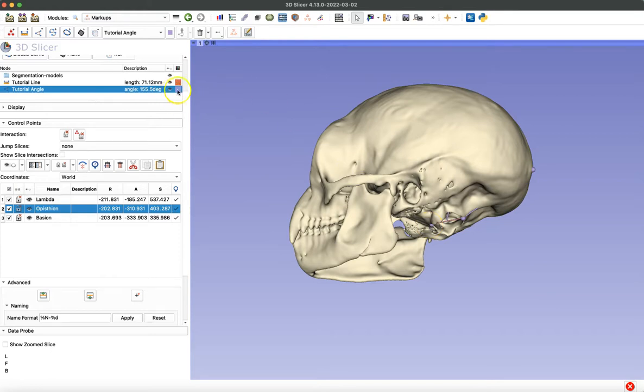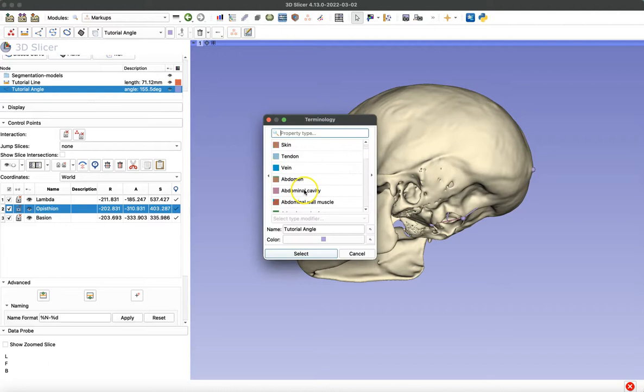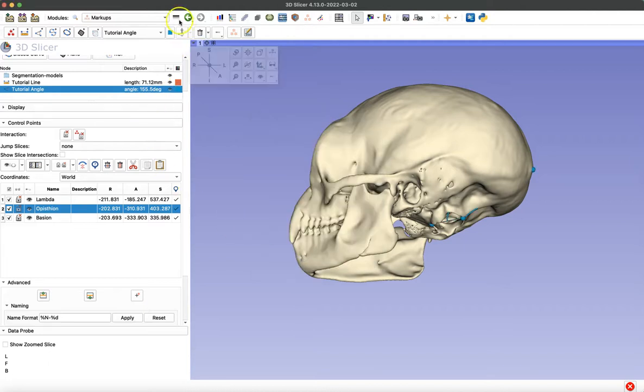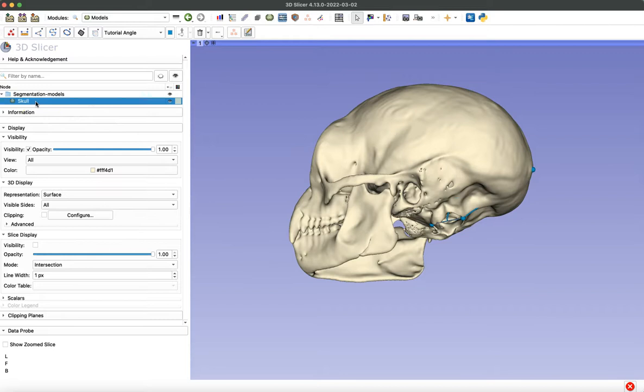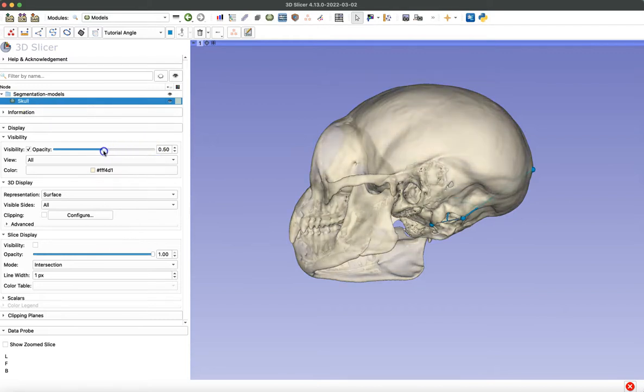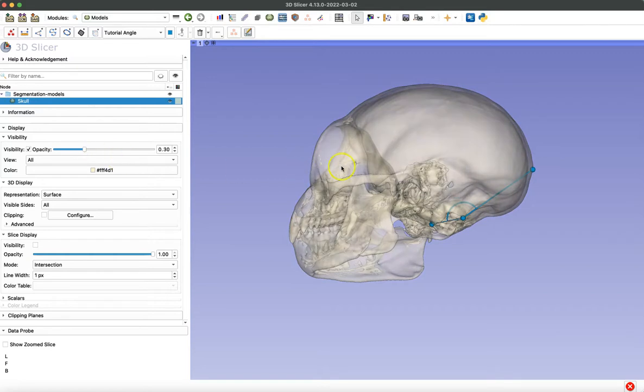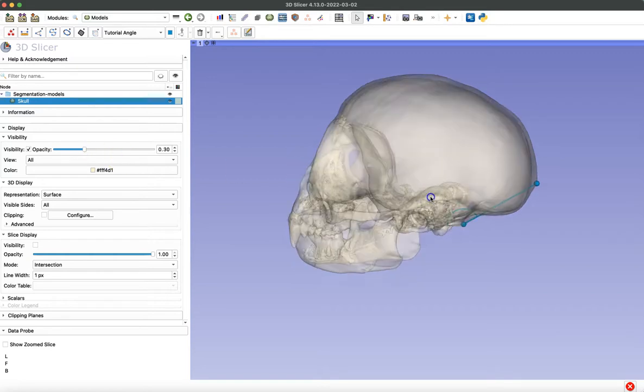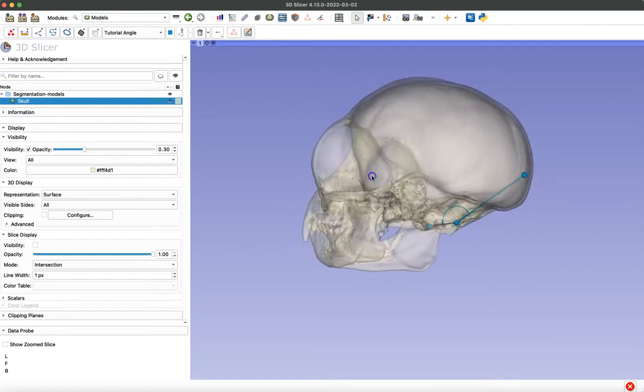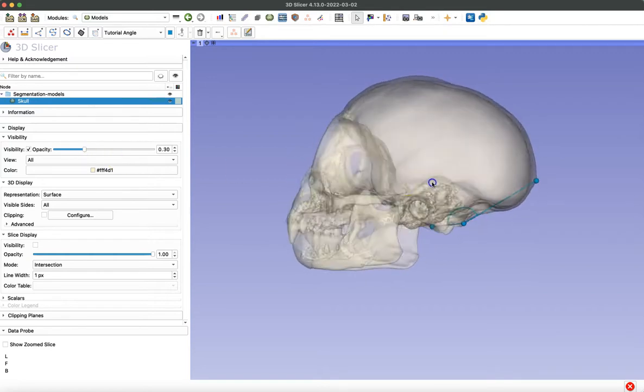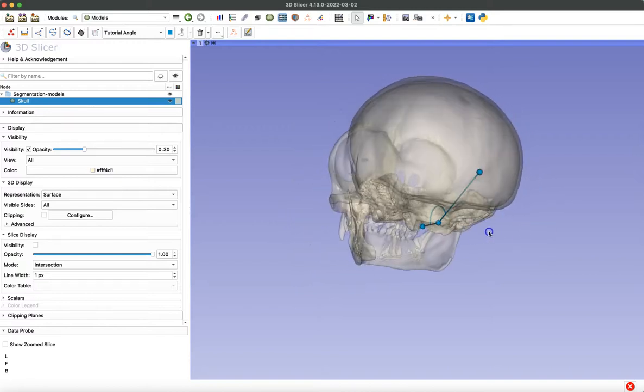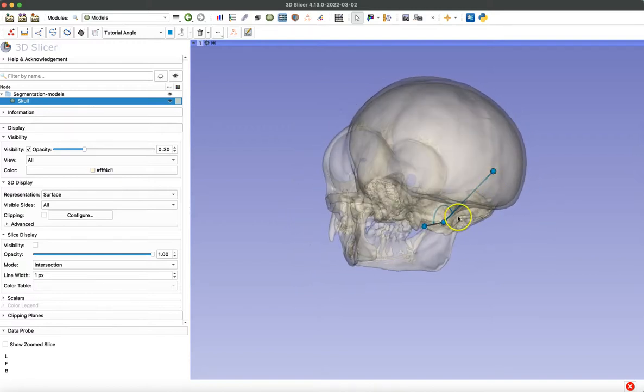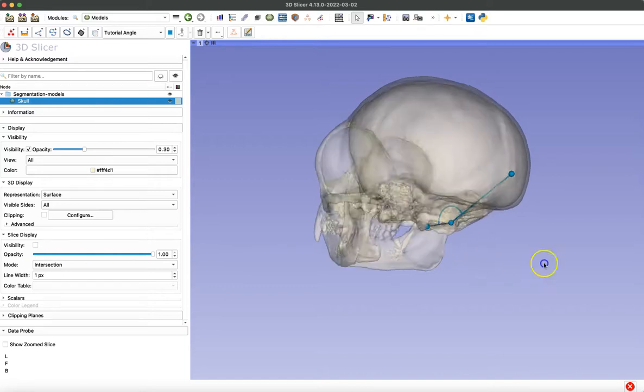I'm going to change the color of that angle we just created and navigate to the models module. Select the skull model that we already have and adjust that opacity so that we can see our angle better. And this is a good tool for creating images of your data or of your workflow process. So now we can see that that angle has changed to be lambda, then Opisthion, then Basion. Exactly what we wanted.